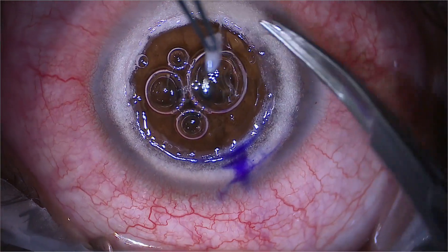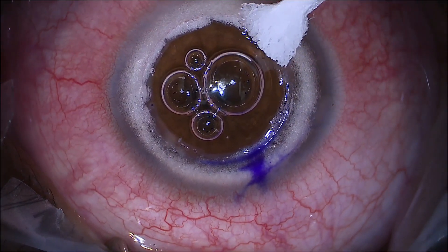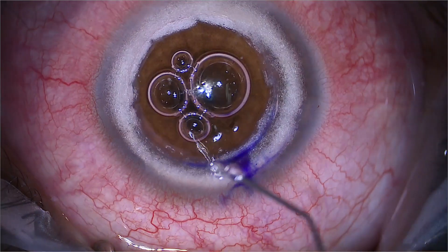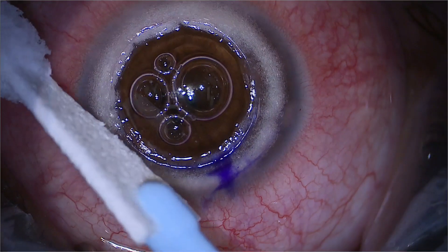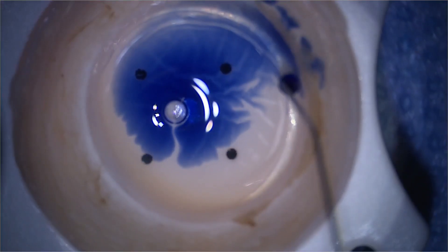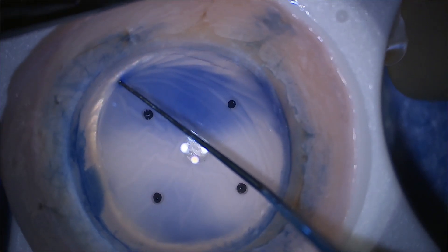I'm just completing the dissection with the DALK scissors. I do this very frequently: use a little spear very gently to make sure there's no residual viscoelastic on the interface, then very gently use BSS to rinse over the surface and gently remove the viscoelastic. Now I'm preparing the donor.